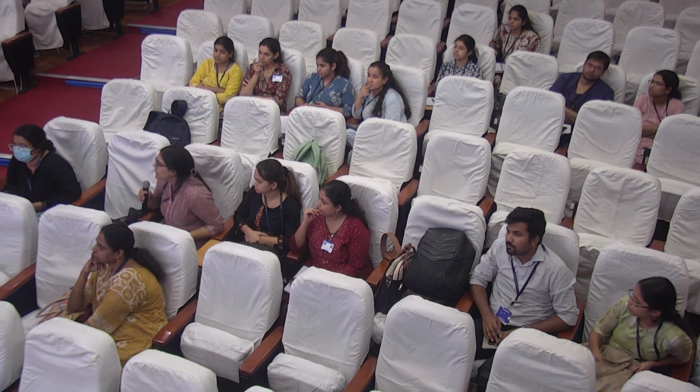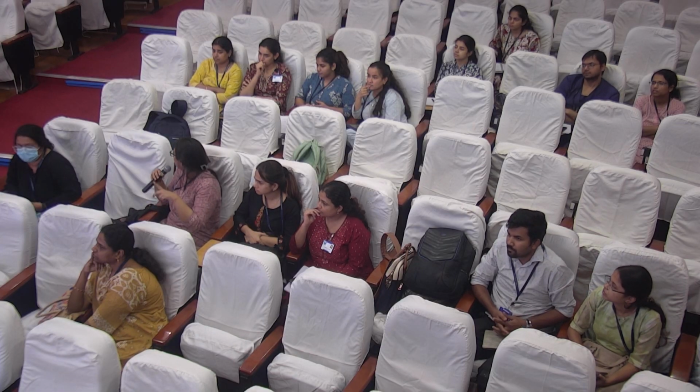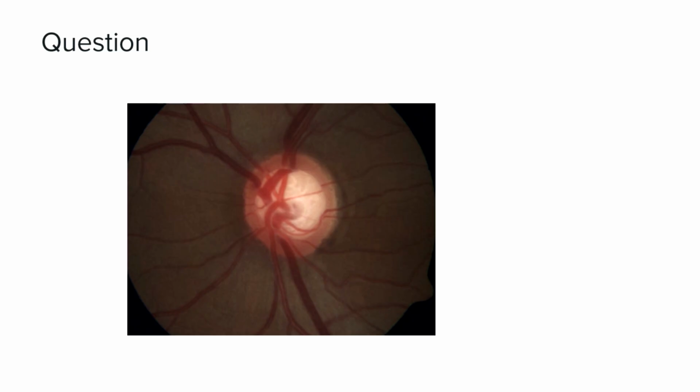Can anyone describe the disc? Ma'am, the first point would be the size. So first you say what it is. It's a color non-stereoscopic photo of the right or left? Ma'am, it is the left. The left eye. Now start enumerating. Size.